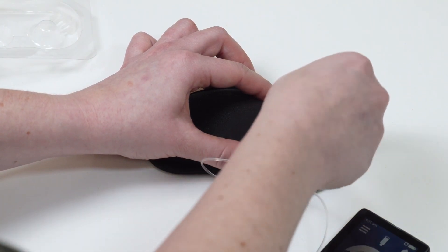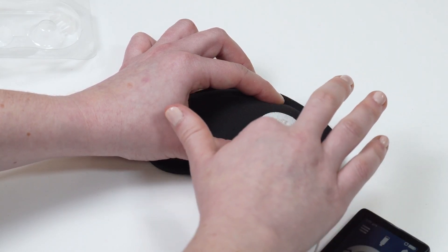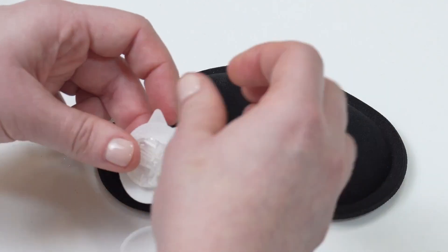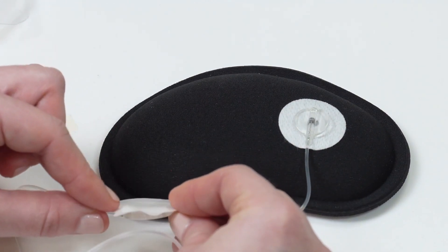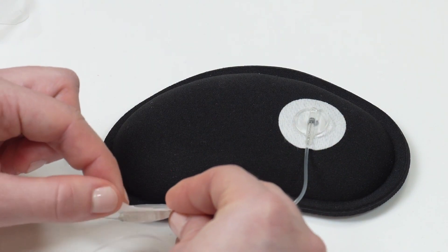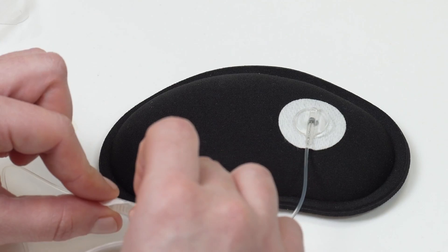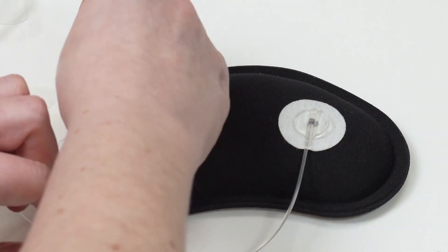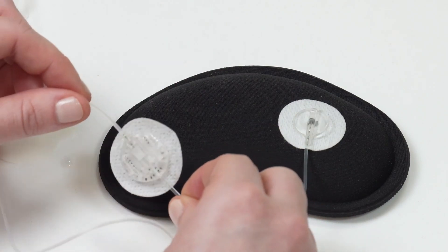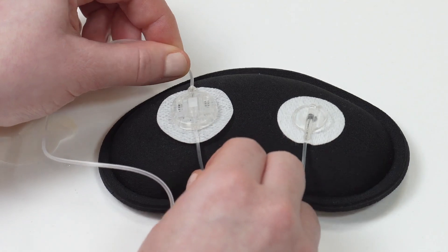Next, you are going to put the anchor in place. Remove the adhesive backing and gently place the anchor on your skin. Rub around the adhesive to help secure the anchor.